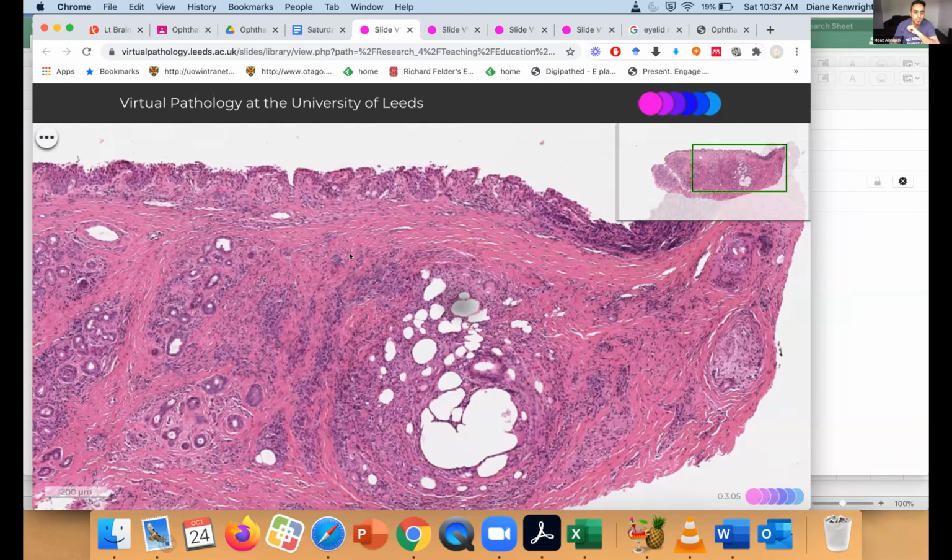One more thing: how do you know it's not sebaceous carcinoma? Will you get giant cell granuloma with sebaceous carcinoma? No, you don't. In sebaceous carcinoma, the lipid remains in the cells, and so you don't get a giant cell reaction, because the malignant cells make it and keep it inside themselves. The frothy cytoplasm thing.